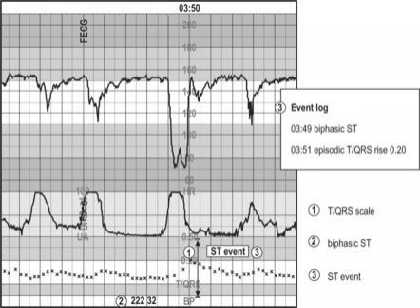They found that the number of cesarean deliveries performed for non-reassuring fetal heart rate tracing was 10%, and for non-reassuring fetal heart rate tracing and dystocia together, it was 7%, for a total of 17% C-section rate. With the addition of a fetal pulse ox, they found a reduced rate of cesarean delivery for non-reassuring fetal heart rate tracing to 5%, and they also found a slight reduction in the number of C-sections for non-reassuring with dystocia to 5% as well. Interestingly, the number of cesareans performed for dystocia alone increased from 9% to 19%.